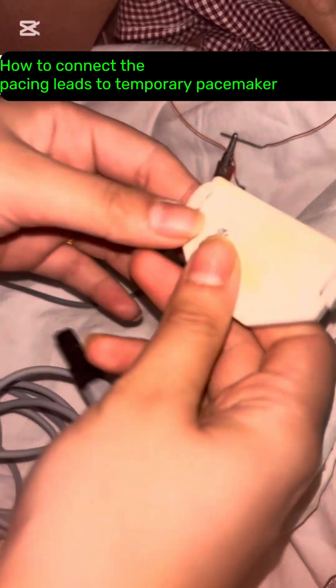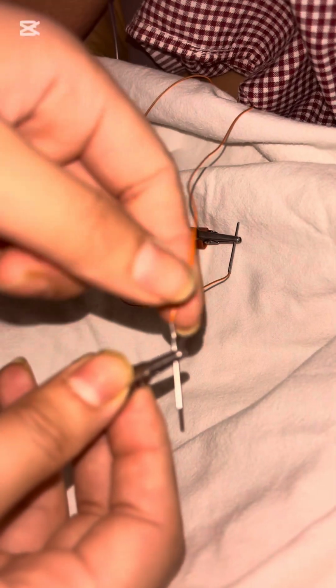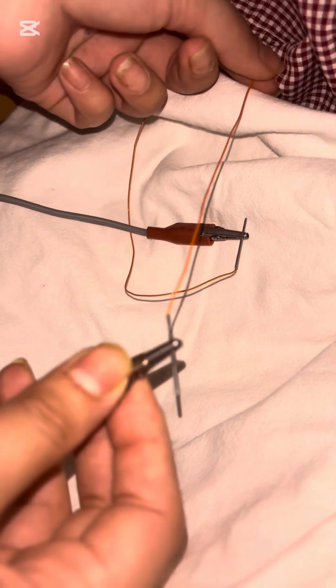Now let's talk about how to connect pacing leads to the temporary pacemaker. We can connect pacing leads to the temporary pacemaker by using connecting cables, as you can also see in the video.